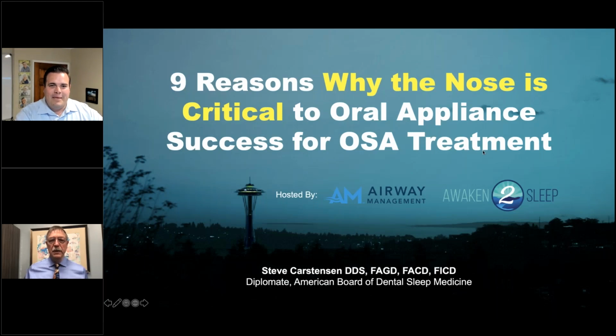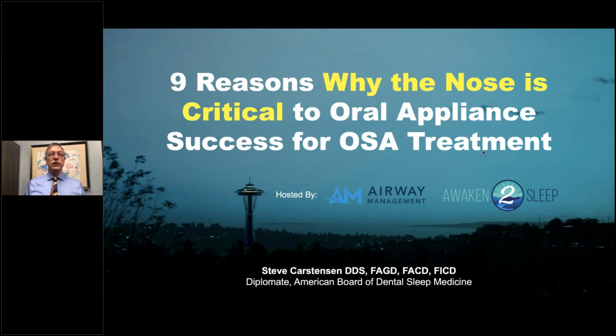There we are. And so this is what we're going to talk about, because my expertise starting in all those years ago was about making oral appliances for adults that breathe badly while they sleep. I'm pretty good at that by now after all this time. I like the appliances that I use. I like matching them with the patients. But what I also realized is that our impact is limited when we pull the lower jaw forward. We can make the tongue get out of the back of the airway. We can tighten up the tissues.